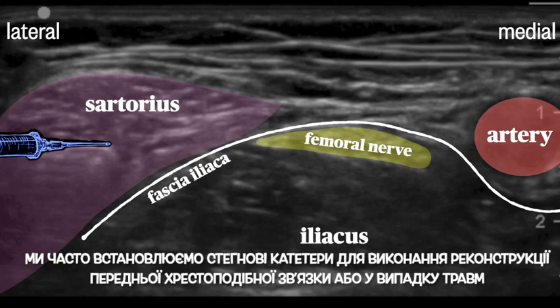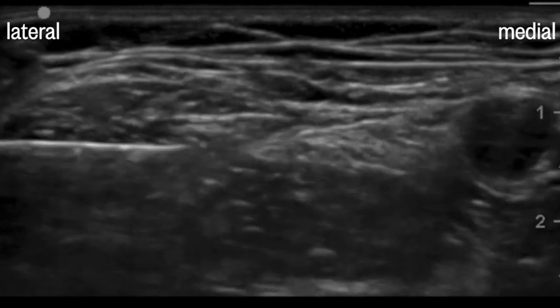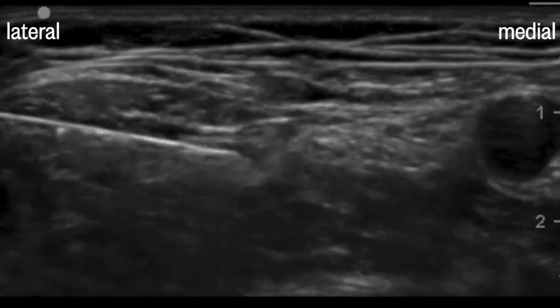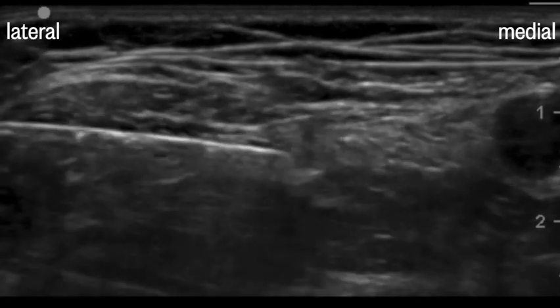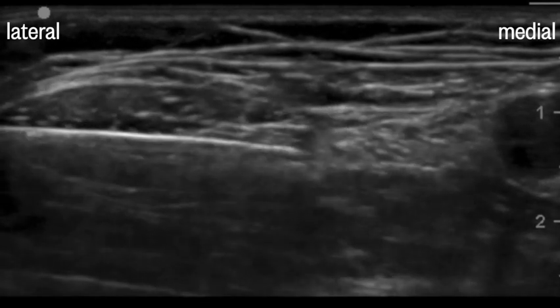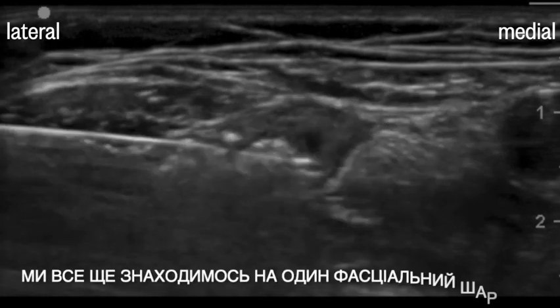We'll often place femoral catheters for ACL repair and trauma — the technique is much the same. You can see the needle here indenting the fascia iliaca. The motor response shows us that we're closer to the nerve. However, this first test injection seems to be spreading in the substance of the sartorius muscle — we're still one fascia layer away.